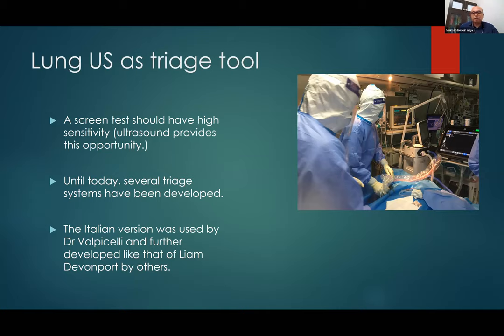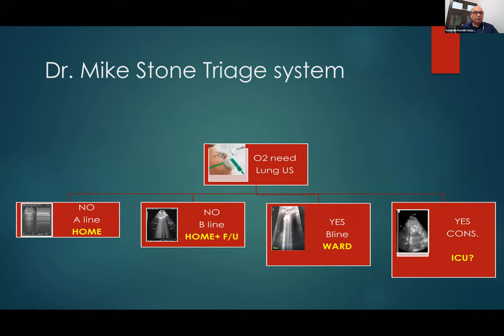Therefore, several triage systems with the aid of ultrasound were developed. Among them, the Italian one that was used by Dr. Volpicelli is well known, which I won't describe because it would be time consuming. But instead, I want to show a simpler triage system identified by Dr. Mike Stone and supported by Butterfly Company, which is published.